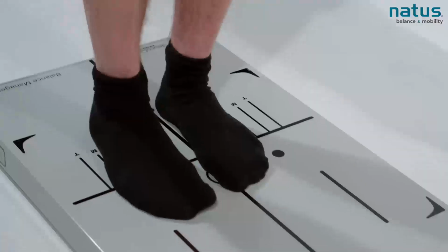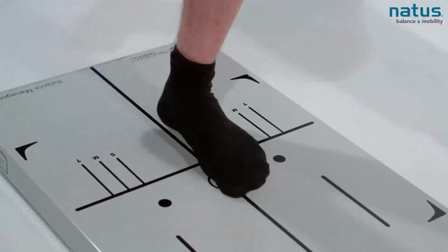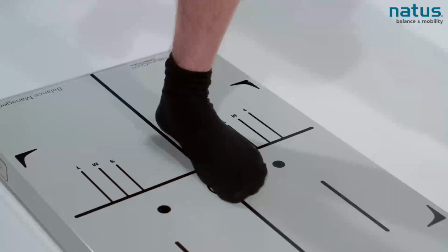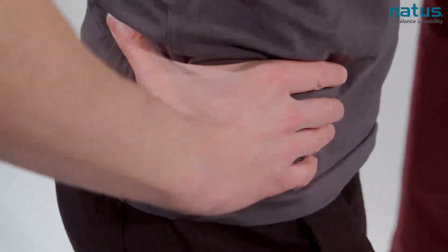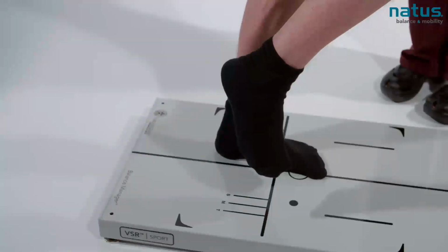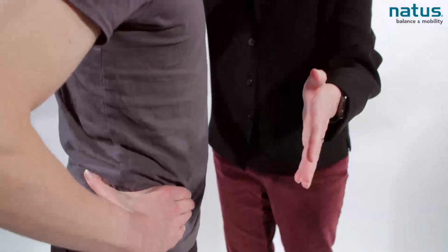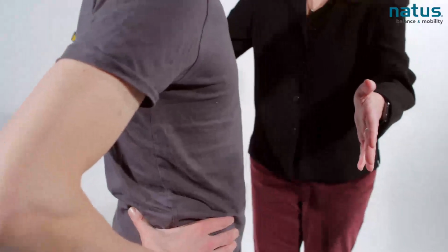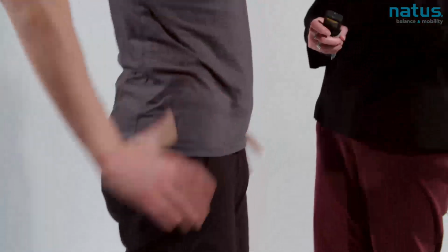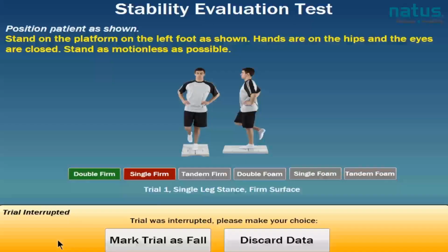Balance on your left foot, close your eyes. Hit the start button. And you can see even after a brief practice, he's more stable for this trial. You're about halfway there. Doing great. He's fighting for it, which is what we see many athletes do during this test. Oh, that was great. You were just barely under the 20 seconds. That was wonderful. So I am going to mark this trial as a fall.